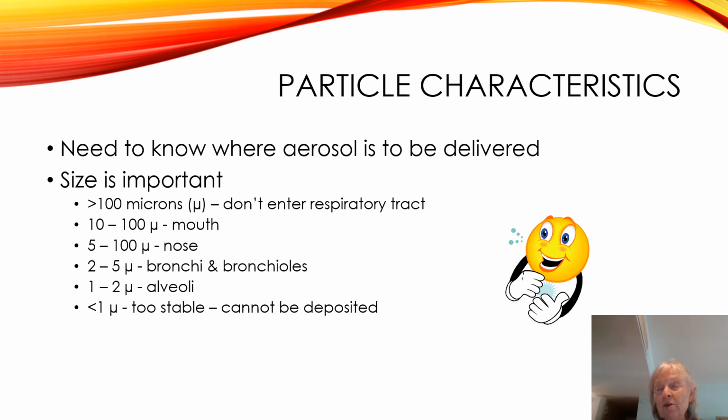If this is something going to the lower airways and your manufacturer says it is for the lower airways and the MMAD is 3 microns, what he is telling you is that half of the particles are greater than 3 microns, the other half of the particles are less than 3 microns. Is this a good medication? Well, it's going to depend, and what it's going to depend on is something we call GSD, or geometric standard deviation, or along that line. I'll get you a better definition of it.